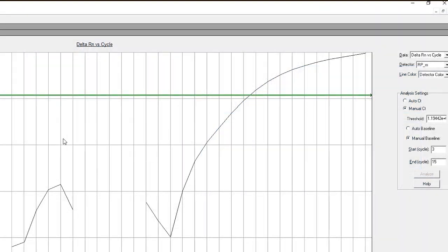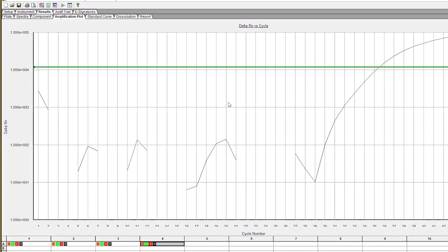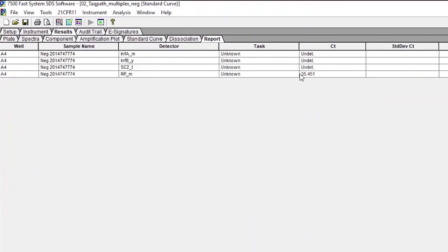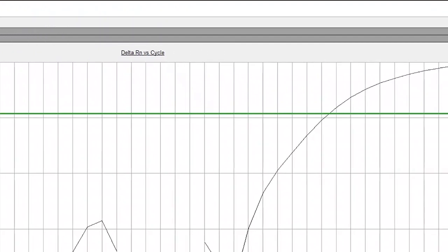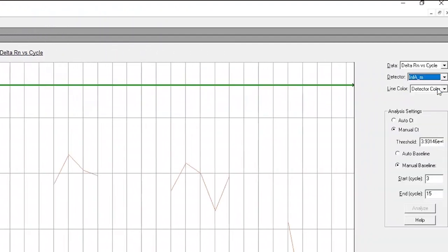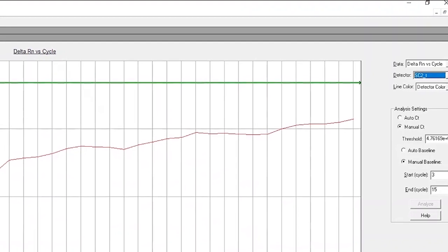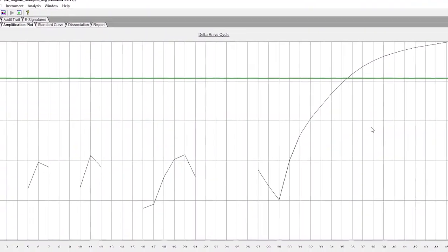If all viral targets are negative, meaning they all have a CT of greater than or equal to 40, and RNAs P generates a CT of greater than or equal to 35, the results should be considered invalid for the specimen. Repeat the testing of specimen nucleic acid and/or re-extract and repeat the real-time RT-PCR assay. If all targets are negative after re-test, report the specimen as invalid. Collection of a new specimen and subsequent testing should be considered.